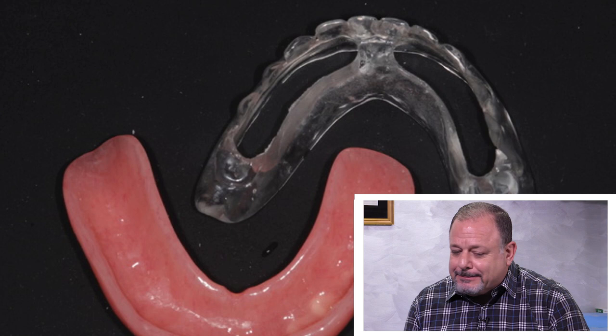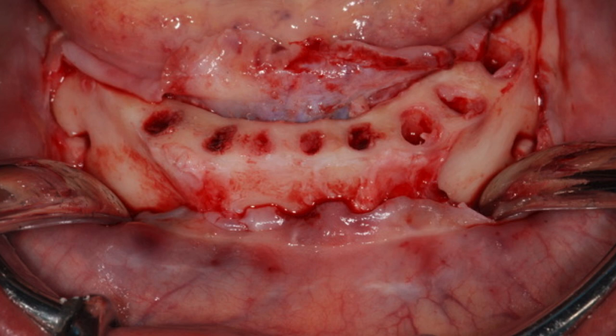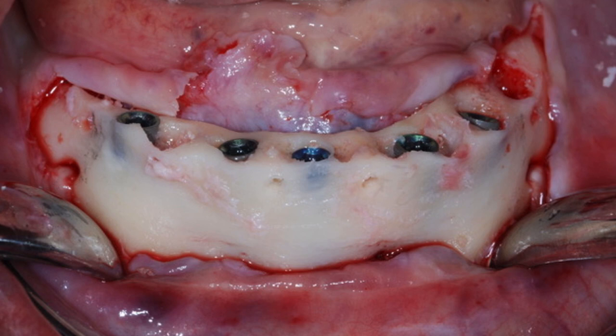So now we've got our measurement from the incisal edge of our denture to the crest of the ridge for prosthetic thickness. We're looking at the apical aspects of the extraction socket. And you can see the mental nerve is reflected on each side of the retractor bilaterally. So this limits our distal aspect of our implant placement. Now after ridge reduction, after we've debrided our sites, we've got the placement of five implants.